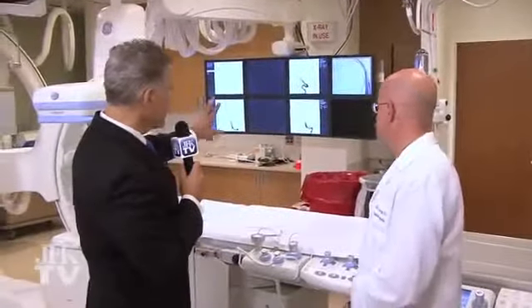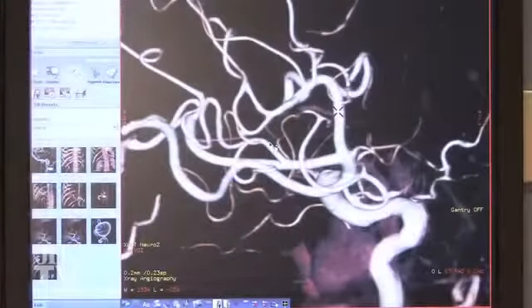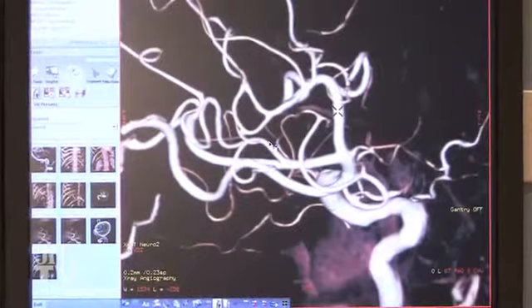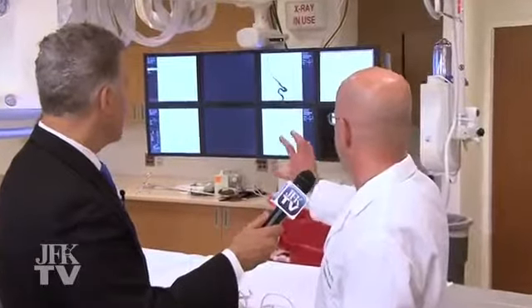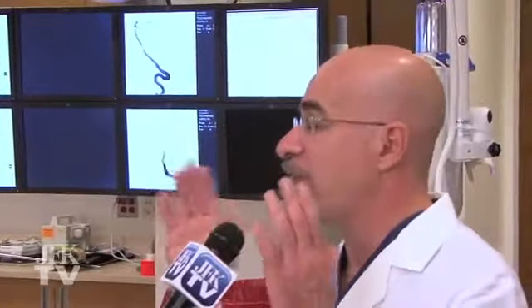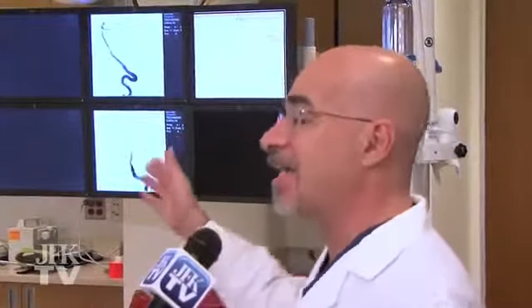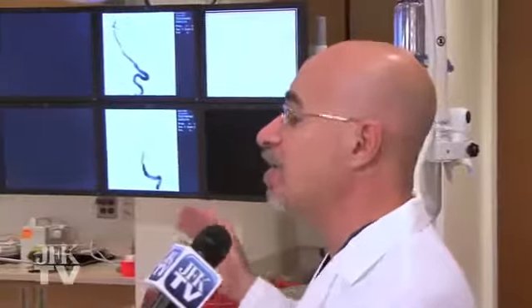If you take a look at some of these different shots that are coming up on the screen here, what does it give the clinician the ability to do that you otherwise wouldn't have? It gives you the ability to see in 3 dimensions in a spinning mode. You can see some of the images in the past were spinning in a circle. You can place the lesion, in this case an aneurysm, in 3D perspective. And you can see where it is in relation to the brain and where it is in relation to the outside of the brain. So if a surgeon needs to go in and do a procedure, he or she can then attack it and know exactly where to go. Or if an interventional neuroradiologist needs to do a procedure, he or she can see exactly where the lesion is and attack it from an endovascular point of view, which is through the vessel rather than through the brain.